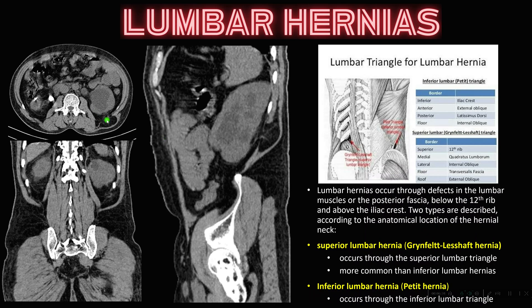Next, lumbar hernias. Here you can see herniation of fat through the superior lumbar triangle — this is superior lumbar hernia, also called Grynfeltt-Lesshaft hernia. The other hernia is inferior lumbar hernia, where fat or intra-abdominal contents herniate through the inferior lumbar triangle, called Petit hernia. Pause the slide and see the boundaries of the superior lumbar triangle (Grynfeltt-Lesshaft hernia) and inferior lumbar triangle (Petit hernia).